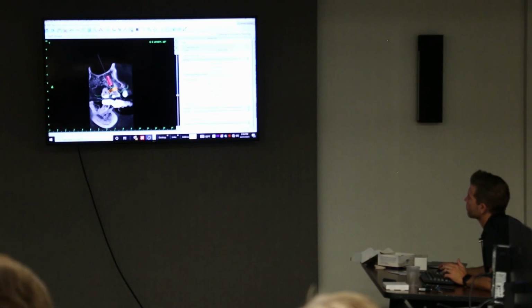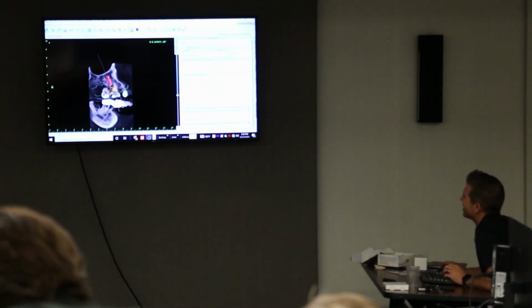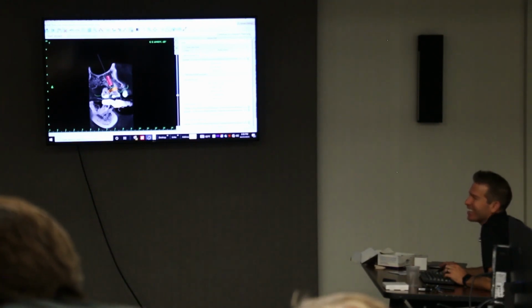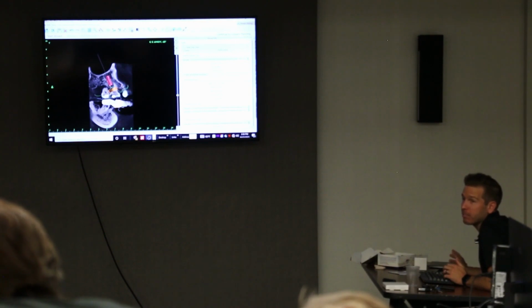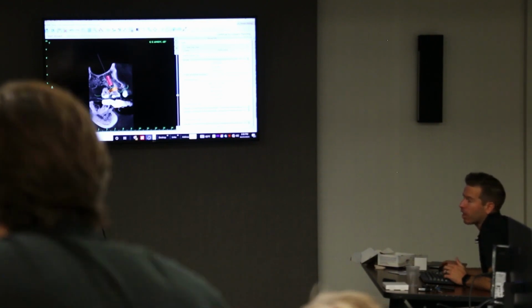Why use such puny implants, you wuss? I know, right? Kind of because I just want to fit it through the guide tube. Is that why? Yeah, exactly. Your bone here is massive. I know. Yeah, obviously this could support an 8mm implant. This ridge is humongous, but you're limited to go fully guided with up to 5s.